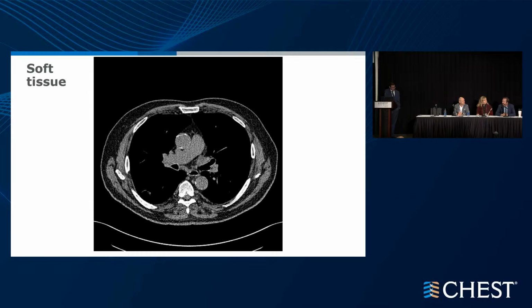You can do a transthoracic needle aspiration of one of them, wait 2 weeks and go after the other one. You could surgerize this patient, or you could do a bronchoscopy. I would do a bronchoscopy on this patient for a number of reasons. One, bilateral lesions, you can target both in the same procedure.